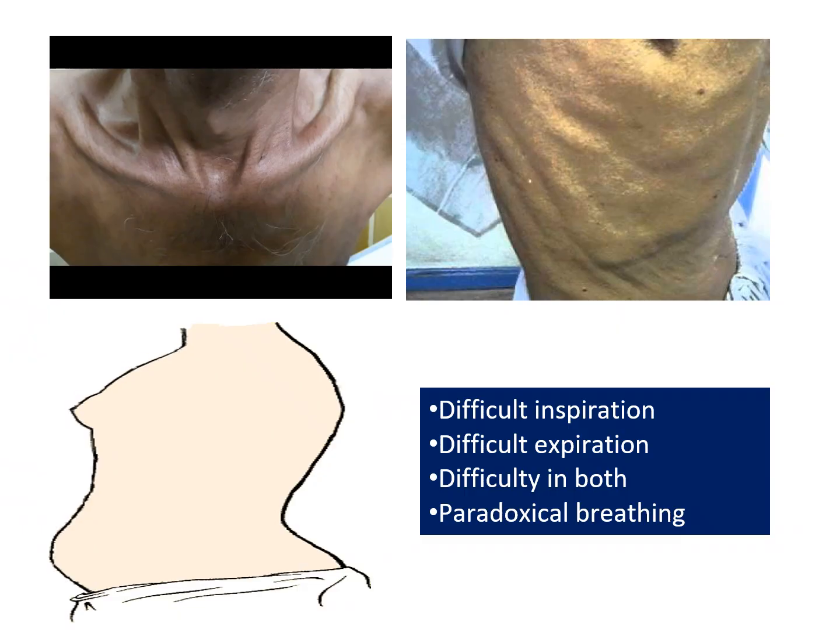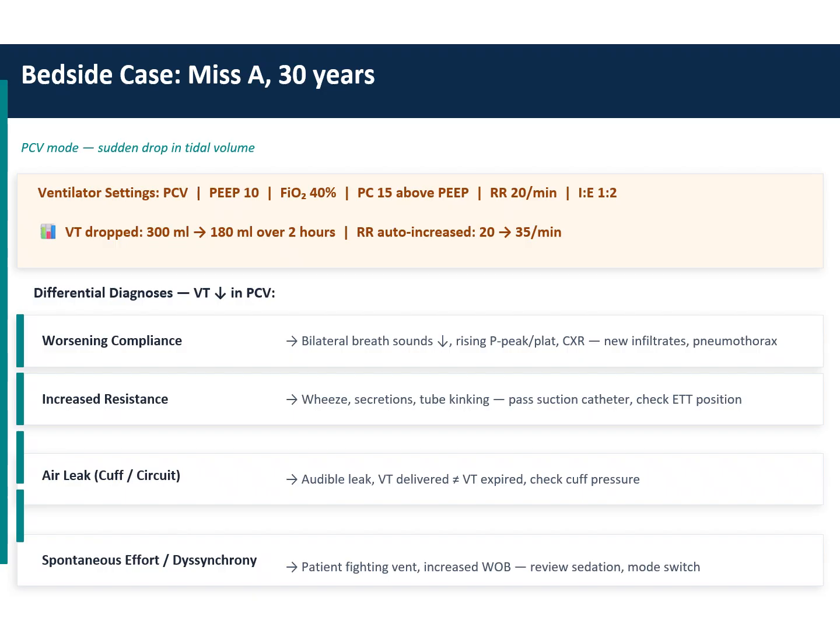So this is how we are going to approach the patients in ICU easily with a simple clinical examination, and that will sort out most of the issues easily. Let us look into one of the cases again.